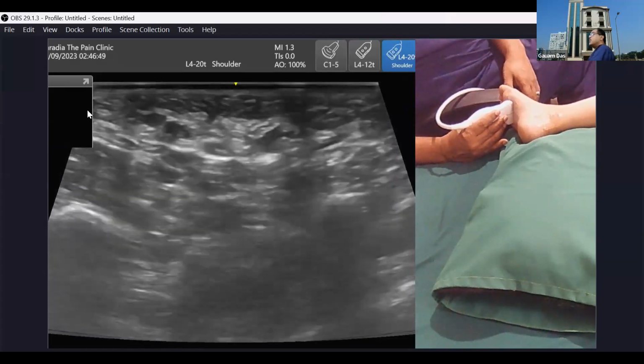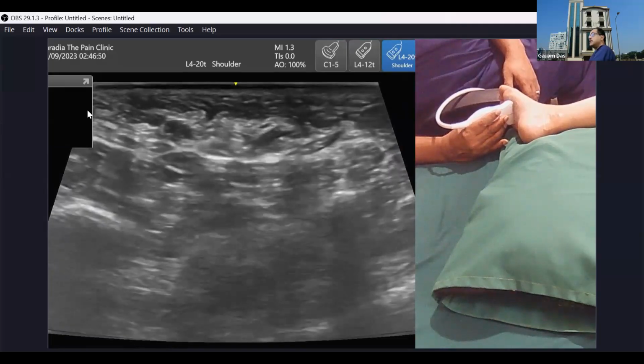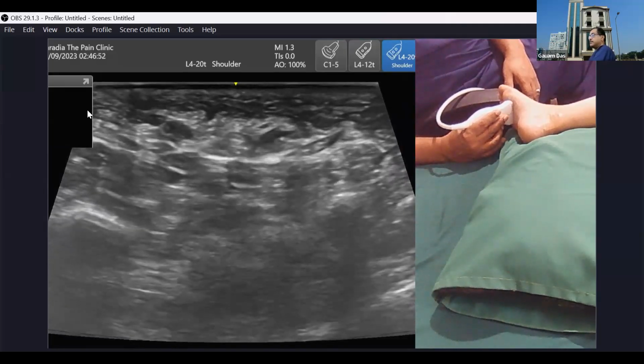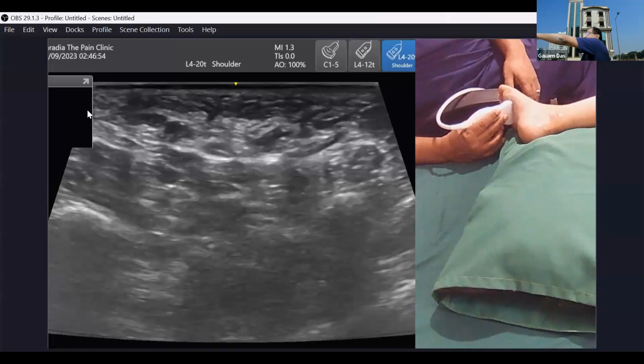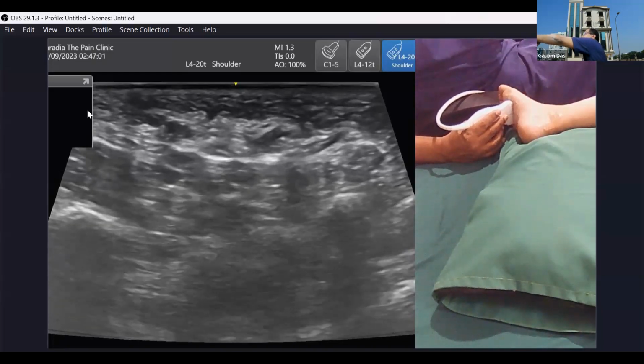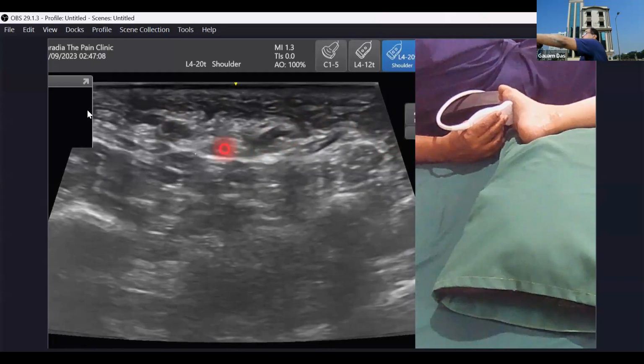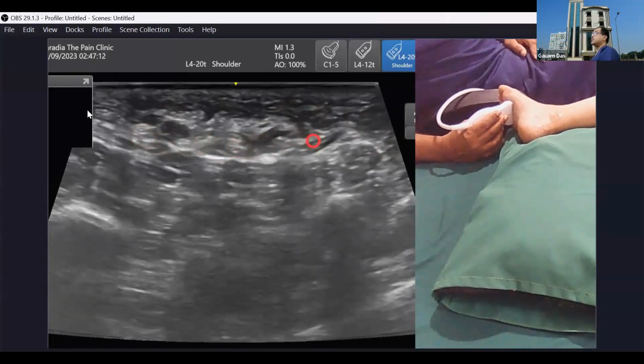So after that, what will be there? Which is there in the second layer? Second layer was flexor digitorum longus. After the flexor digitorum brevis. So this part is your flexor digitorum brevis. So let me take this view. So this is your flexor digitorum brevis. After that, you can see the tendons of the flexor digitorum longus.